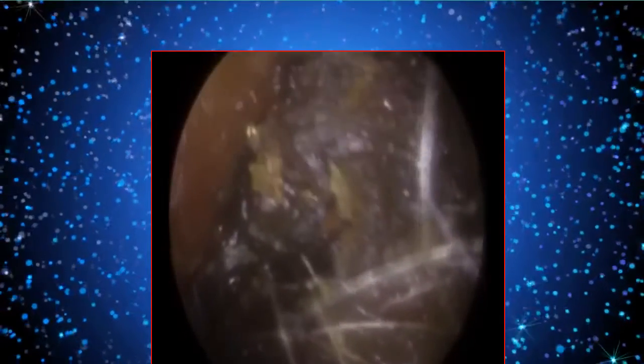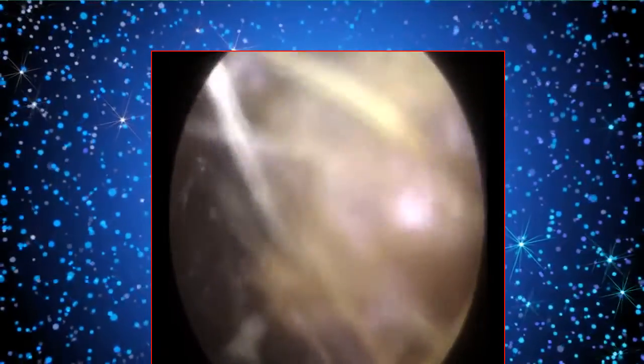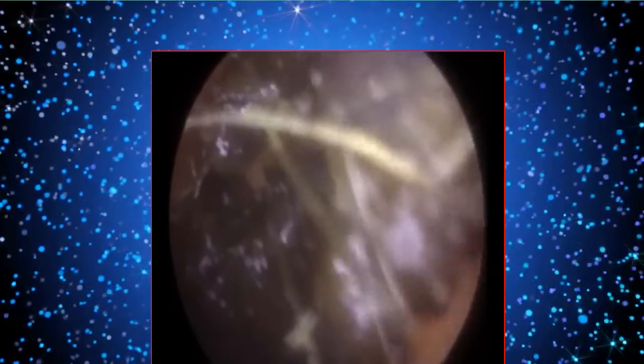The patient wasn't using drops in this ear, and the reason for that is the client originally was going to visit their GP or nurse and have this ear irrigated with water. Prior to performing irrigation, previously called syringing, you would have to instill some softening drops such as olive oil drops or hydrogen peroxide drops or sodium bicarbonate drops.